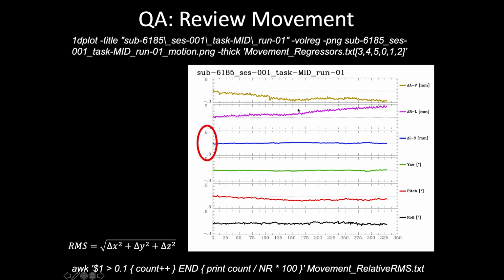There's a little bit of motion, but one of the things you've got to pay attention to are the values on the y-axis, because AFNI will scale it based on the data. If your voxels are 2 millimeter, but this person really moved less than 2 millimeter over the course of the scan, and this was task-based, I wouldn't worry about this one because it's pretty steady.